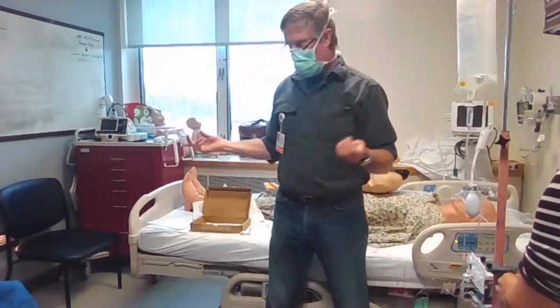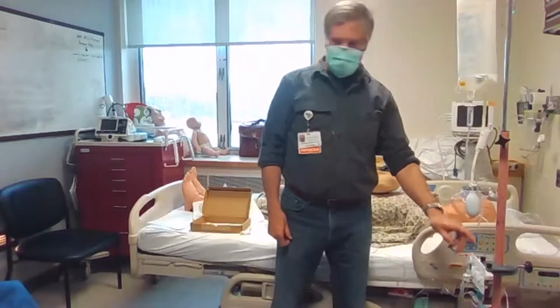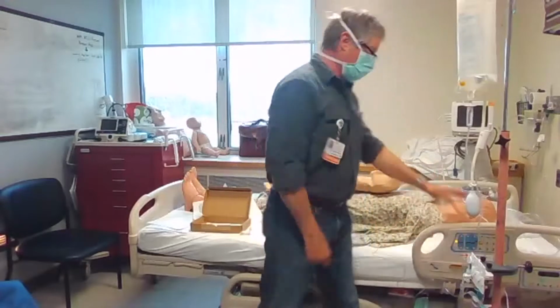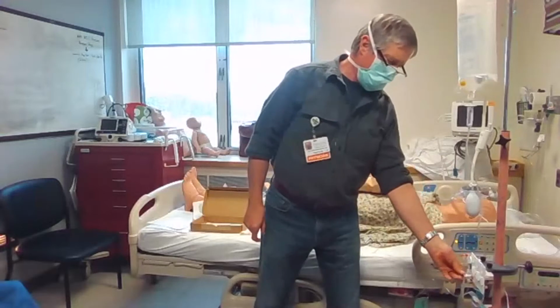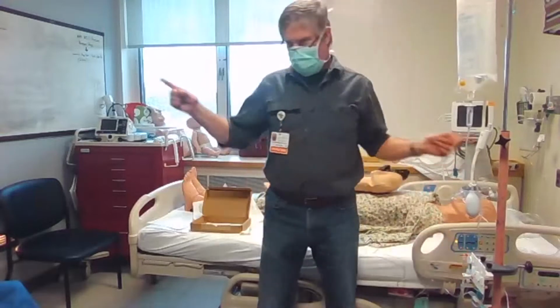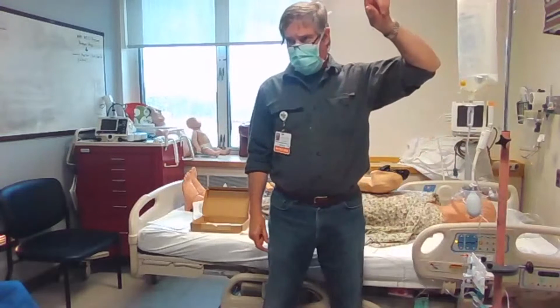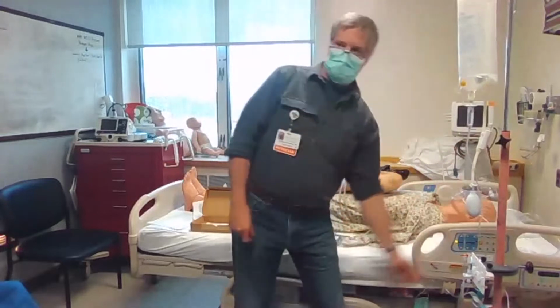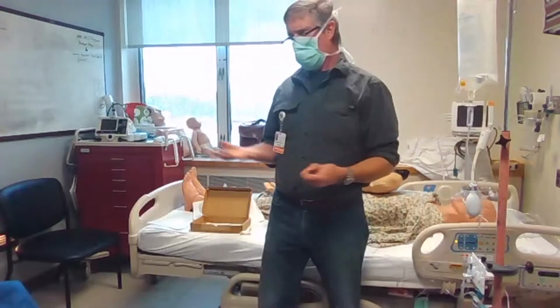Another little trick with this that I like to do is you can zero this from anywhere, so I can set it up to where I want it, and then I don't have to move it anymore. I can hook up a little 3-foot extension, put fluid in it, make it a solid column of fluid, and then you can zero it to wherever you want. So it makes it really easy if you're taking care of somebody over a long period of time.